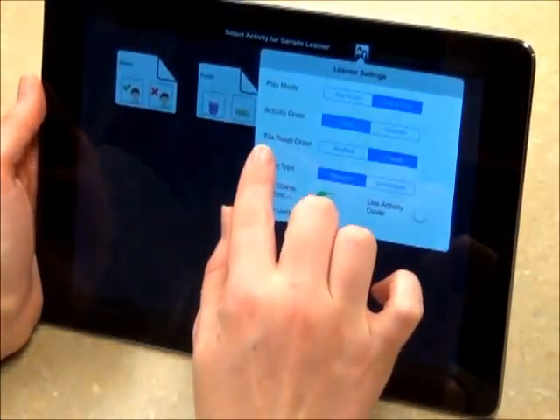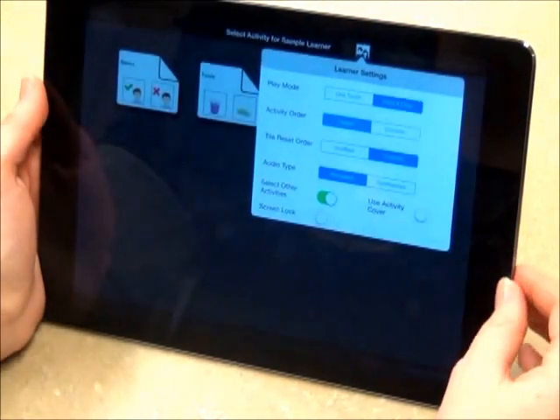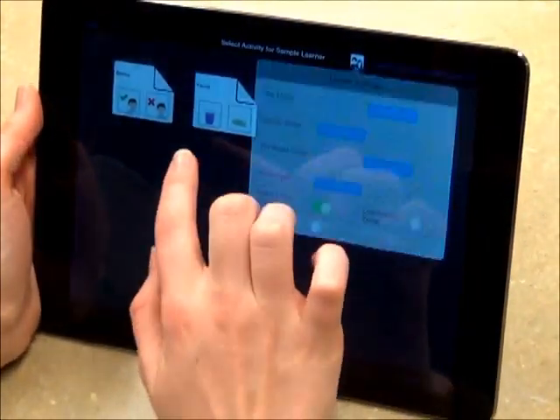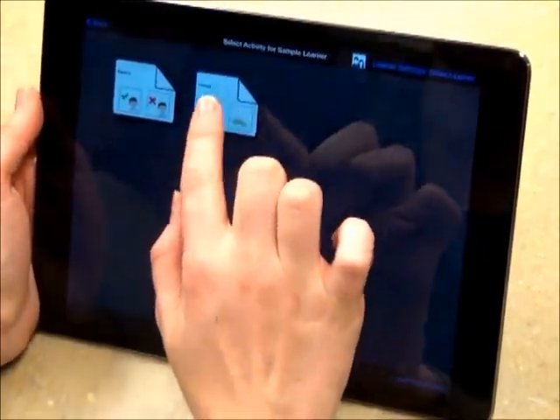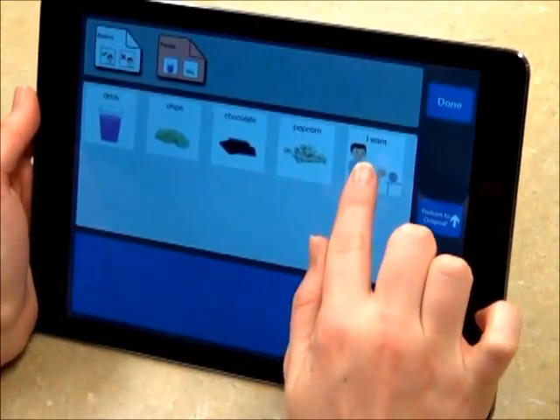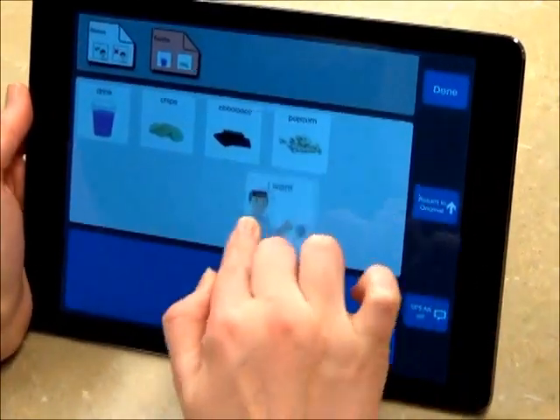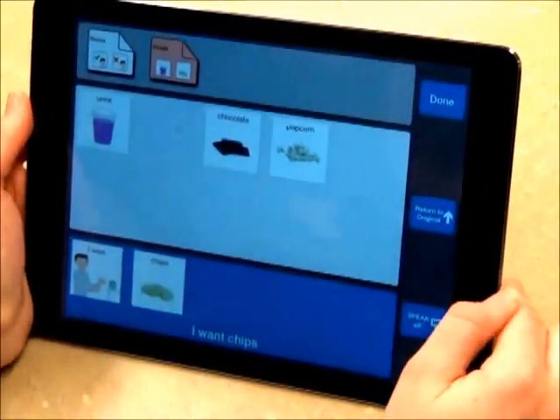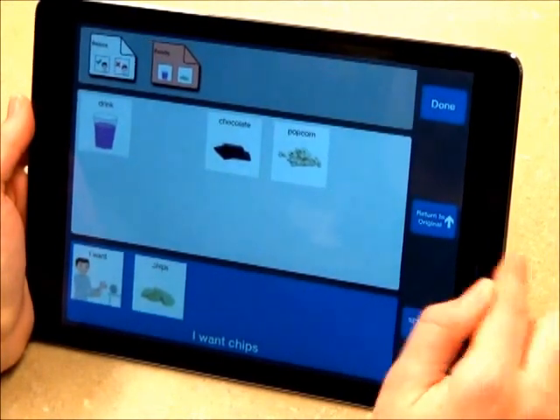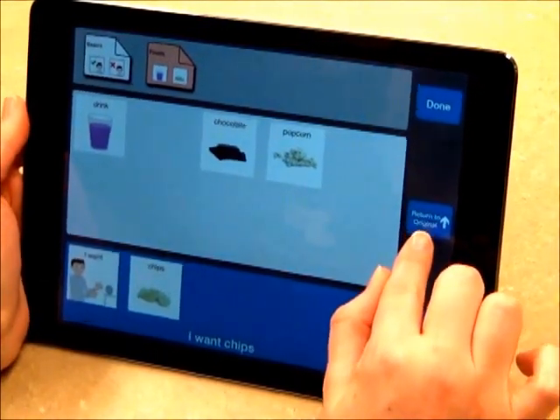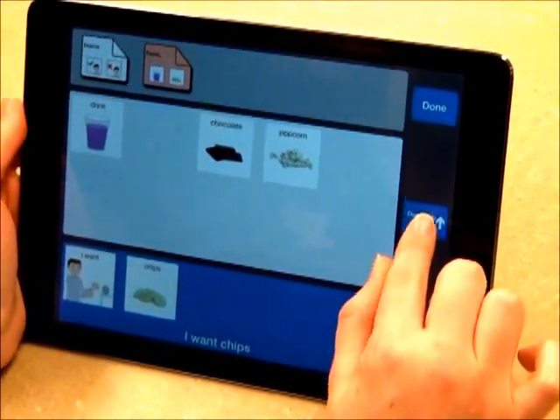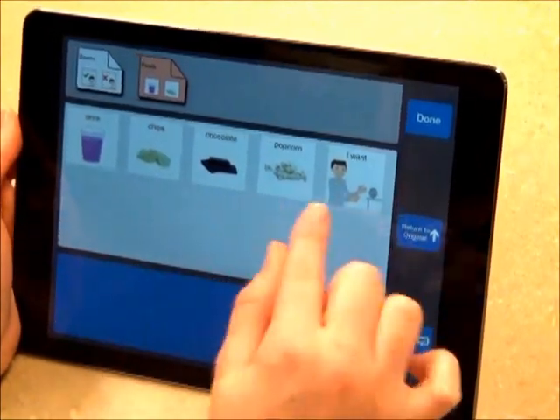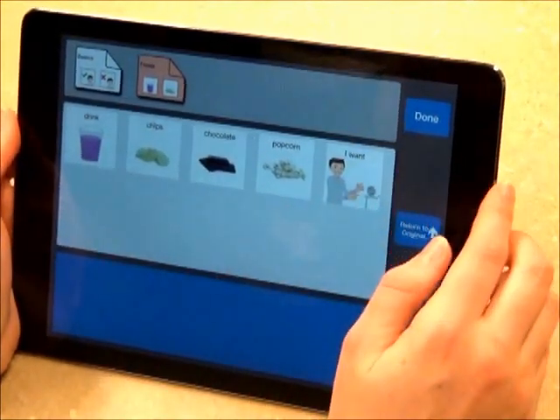Next, I will explain tile reset order. Right now, original is turned on. If we enter this activity and put the symbols down — I want, Chips — you will see that this button says Return to Original. If I press it, the symbols return to their original position.